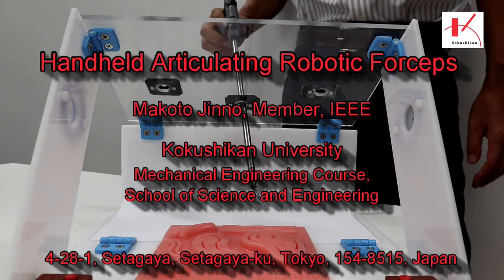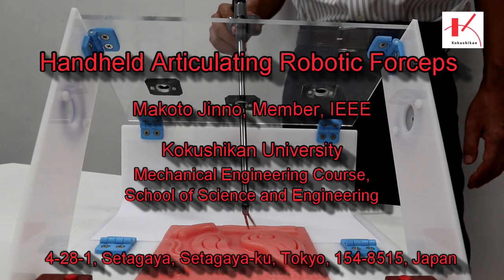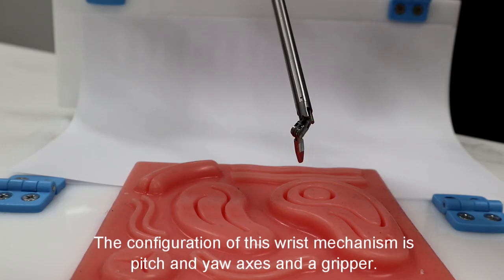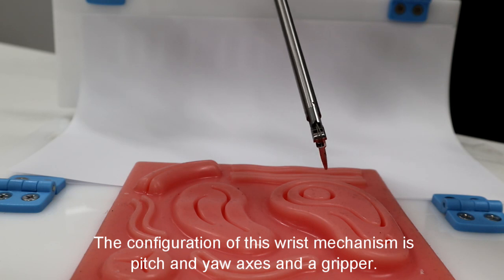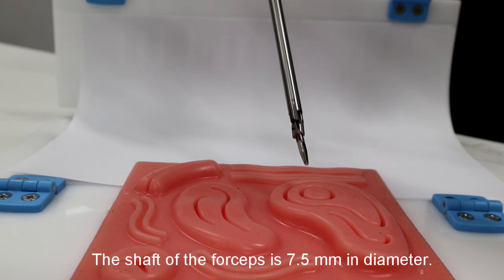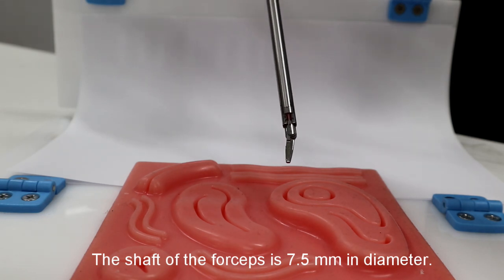This video presents a handheld articulating robotic forceps with a simple non-interference mechanism. The configuration of this wrist mechanism is pitch and yaw axis and a gripper. The shaft of the forceps is 7.5 mm in diameter.